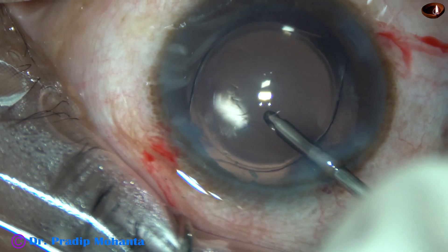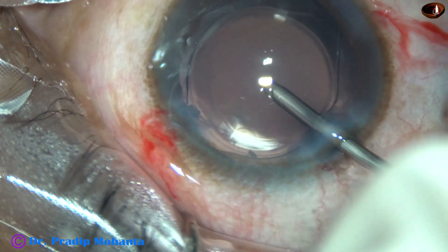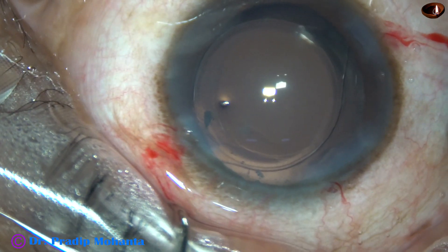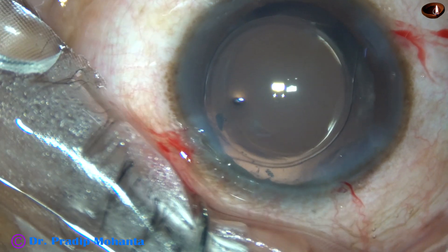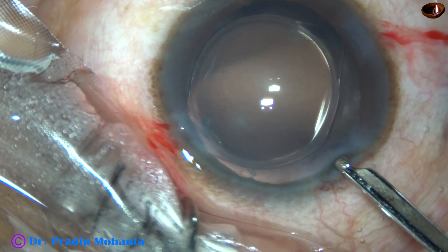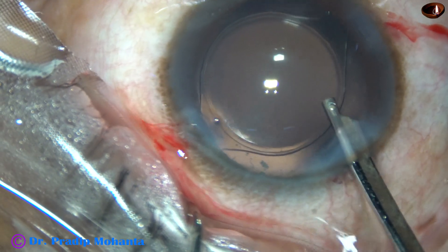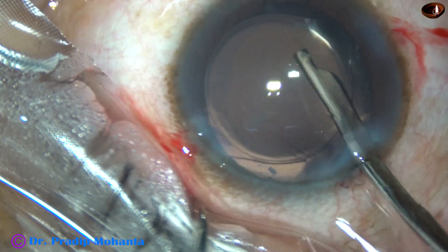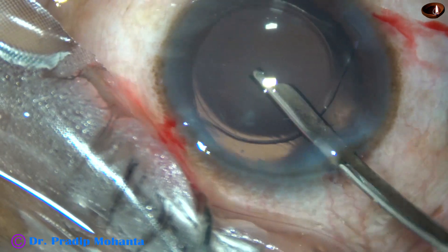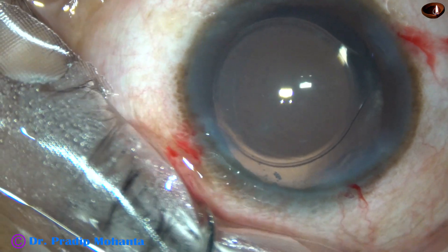This is a hydrophobic acrylic single-piece monofocal intraocular lens, and the lens has gone into the capsular bag. Now watch — the optic of the intraocular lens has been nicely overlapped all around by the rhexis. If this happens, the lens never tilts and is always nicely centered. The lens never tilts if the optic of the intraocular lens is nicely overlapped by a thin rim of anterior capsule all around.